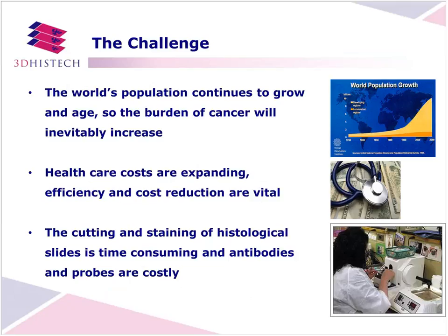As you probably already know, the world population continues to grow and age, so the burden of cancer will inevitably increase. Health costs are expanding, so efficiency and cost reduction are vital.